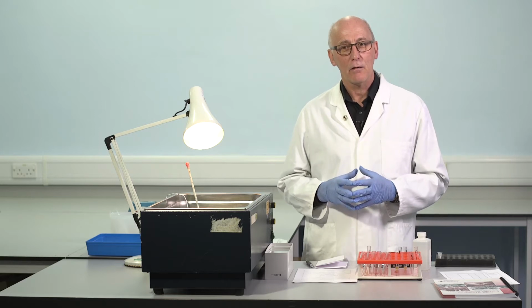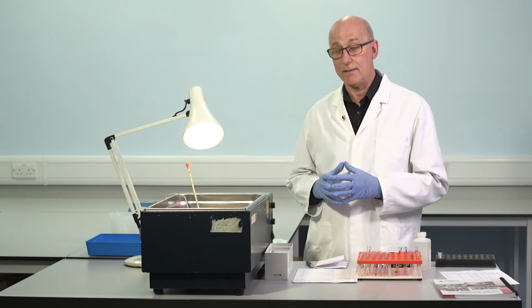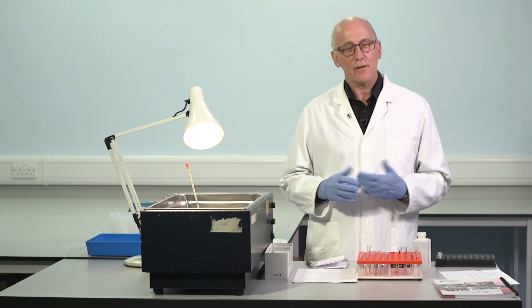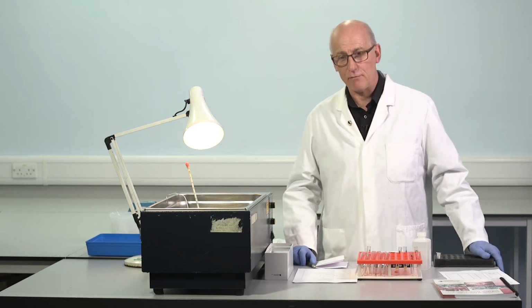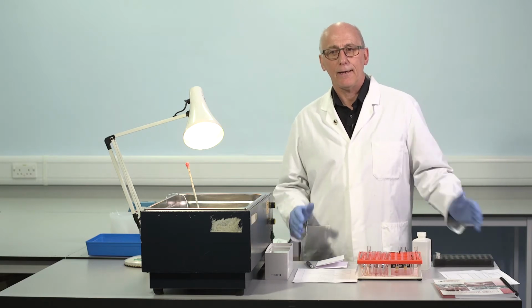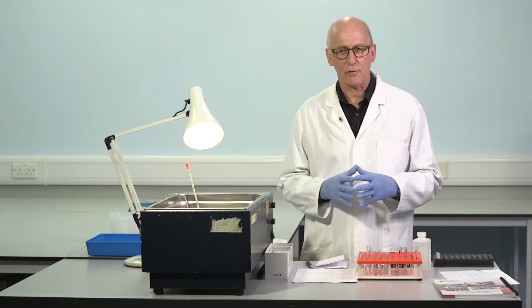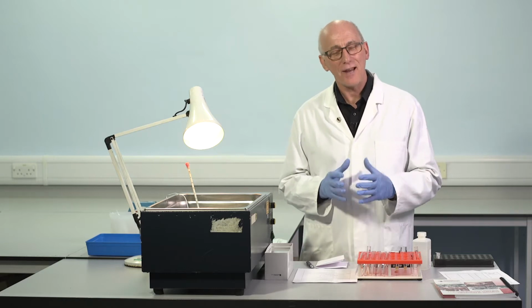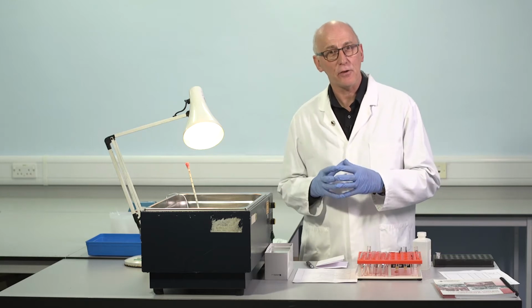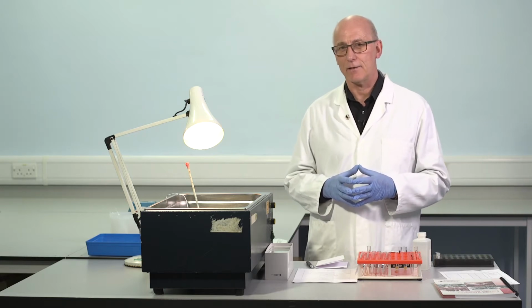And I think we're also very fortunate in hemostasis that actually the results of a manual factor VIII assay in the water bath are perfectly acceptable for patient management purposes. That's unusual in laboratory tests, and many areas of laboratory testing, cell counting, clinical chemistry. I think it's true to say that manual equivalents are so time-consuming and in particular are unacceptably inaccurate or imprecise that they can't be used for patient purposes. They're simply not safe. That's not the case for factor VIII assays.